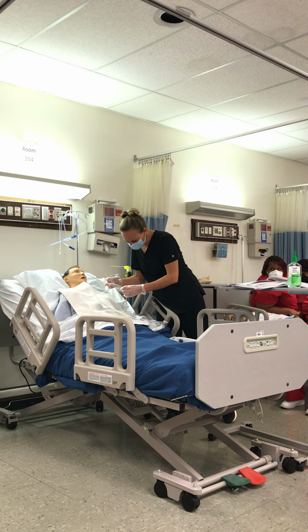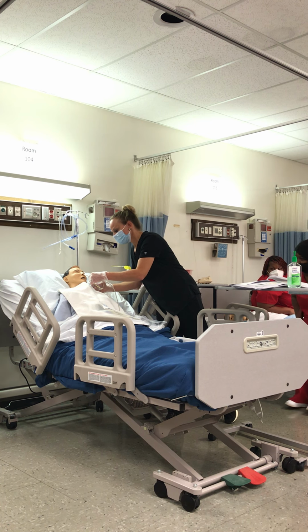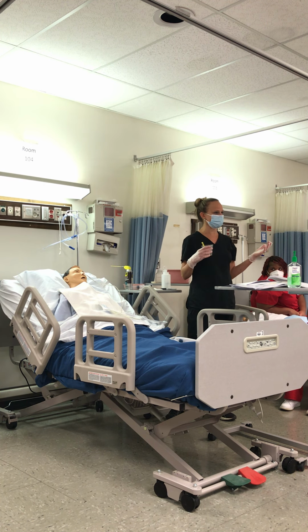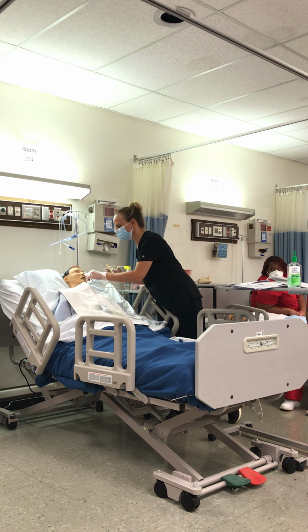What am I looking for? Your mark. My other mark. So, take a swallow, okay? What if he raised his hand now, what would I do? Stop. What else would I do? Retract a little. Nuh-uh, what would I do? Retract what? Rotate. No, no, we tried it all the way. We're choking him. It's going in his lungs, what do we do? Pull it back. Pull it out. Pull it back to the what? First mark. First mark, because that's a safe place, right? So we're back to our first mark.